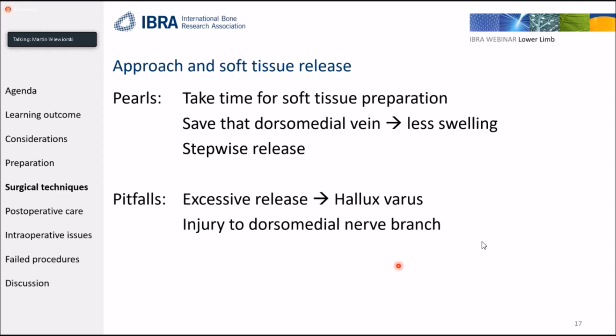I think you should take time for the soft tissue preparation. It's only maybe 2 or 3 minutes more, but your patient will like you for that. If you just preserve those, especially this dorsal medial vein that runs along the upper border of the incisions on the TMT1 joint, MTP1 joint, it's always the same vein.